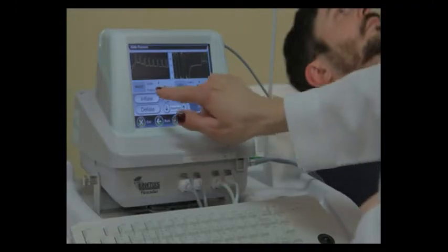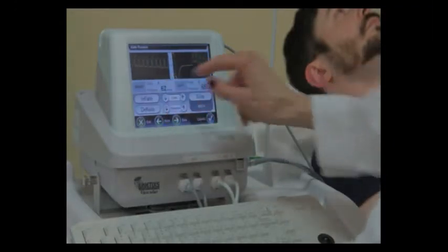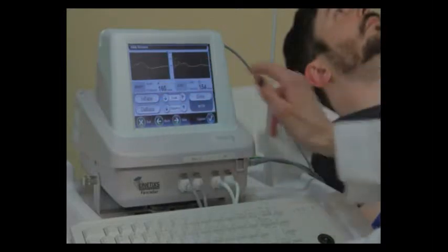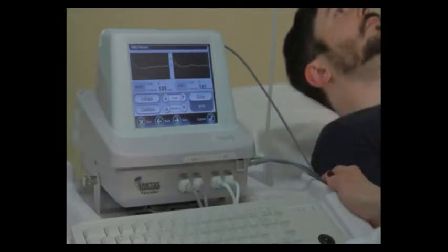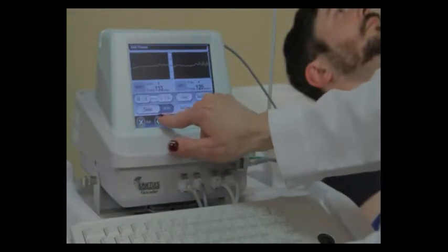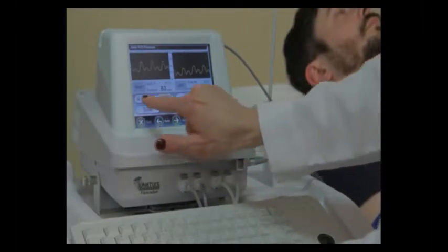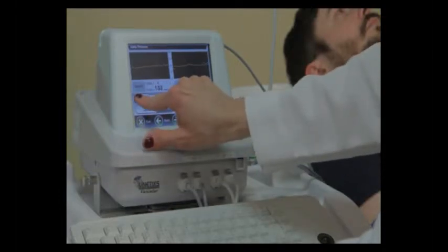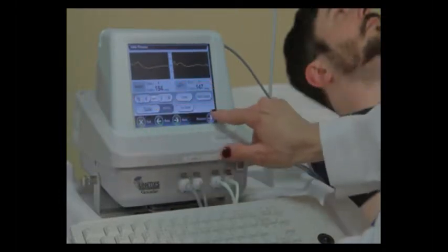We can see the waveforms coming across the screen, so she's going to press the inflate button and this will automatically inflate the cuffs at the ankle. Now that we see a flat line, she's going to press the deflate button and wait for the return of pulses. We're going to scroll them back to the blue bar at the right of each screen, and our study is finished.